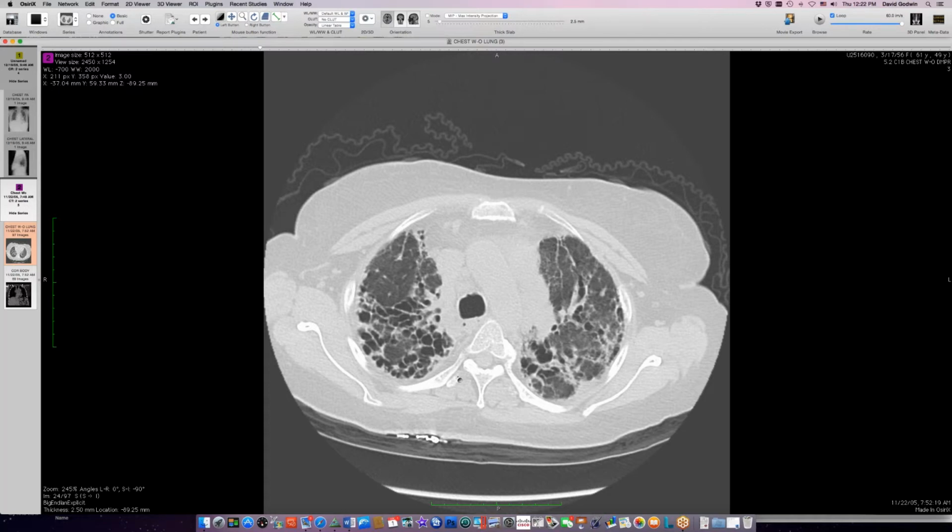A case yesterday of a scleroderma patient with an NSIP-looking lung, but had some similar, even thinner wall bubbles in the upper lobes anteriorly, kind of away from all the other stuff. Makes me think about that.